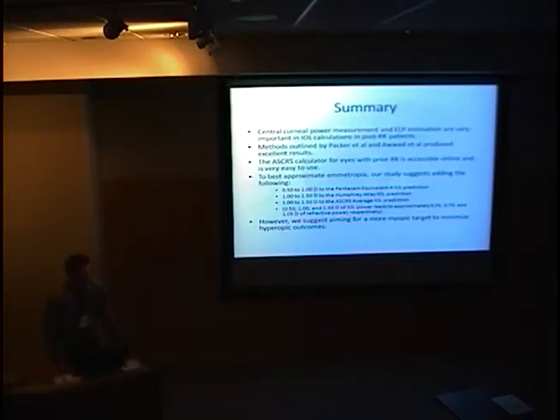Thanks for bringing up the contact lens method. I forgot to mention there was an article by Dr. Chen and Dr. Mark Manis from UC Davis in 2004, I believe, where they used the contact lens method and the historical method, and they used the flattest K's from those two, and they published their outcomes, and still they wanted to aim more myopic. But it's a good thing. The more measurements, the better. And to average those out, it gets rid of the outliers.